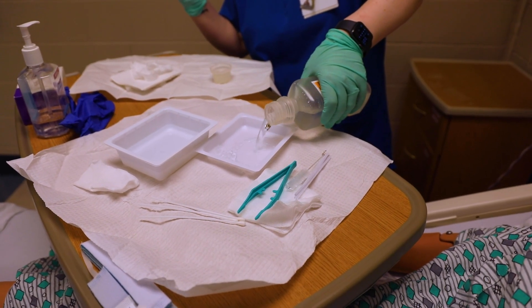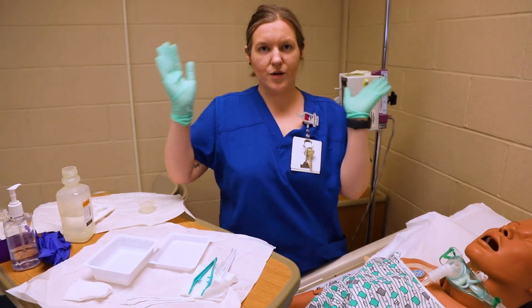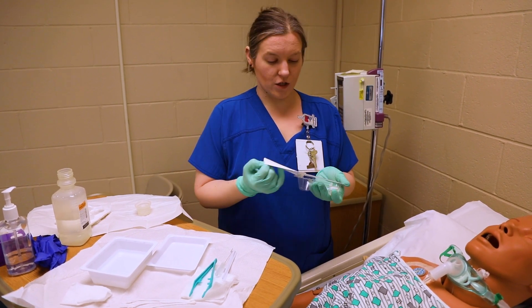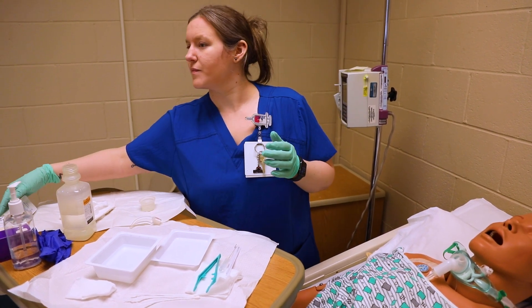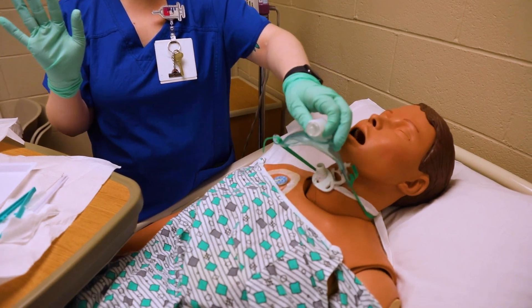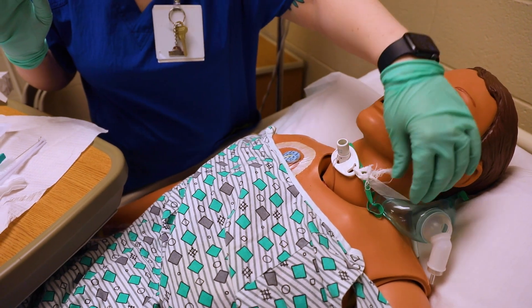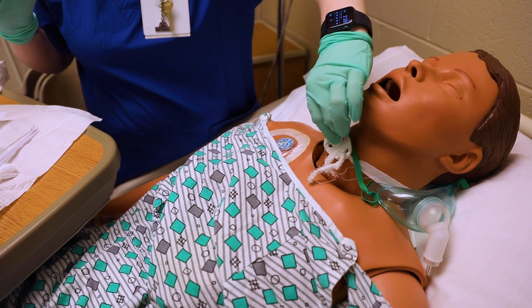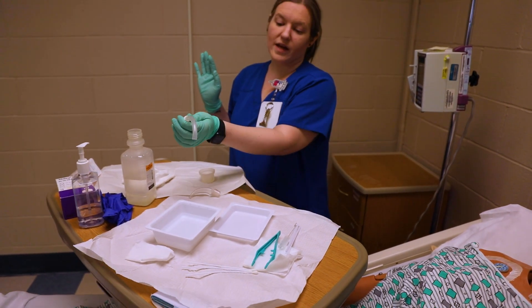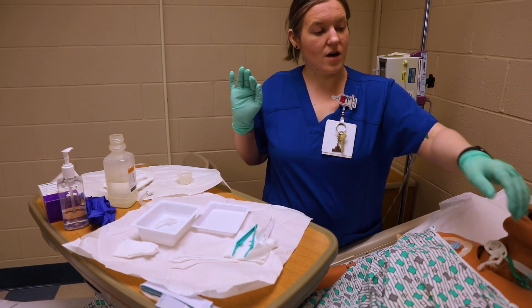I'm going to rearrange a little bit of my kit, pour a little in there for a rinse. I'm going to pause here because I want to clean a trach for you, but I don't want to put the one going back into the mannequin in the water, so I'm going to use this one as a stand-in. Now — sterile hand, clean hand — the patient is oxygenated, so I'm going to take the oxygen off. I'm going to monitor the patient's oxygen level. This trach you twist and then pull out; I bring it around and drop it in.